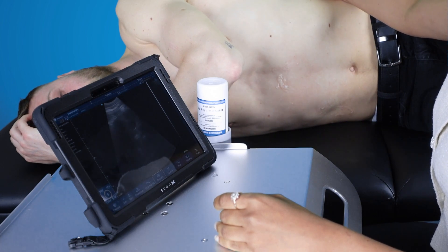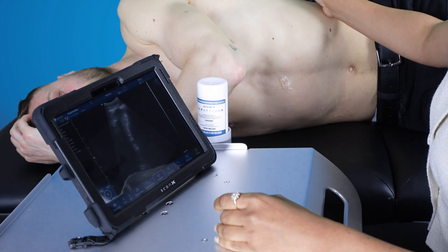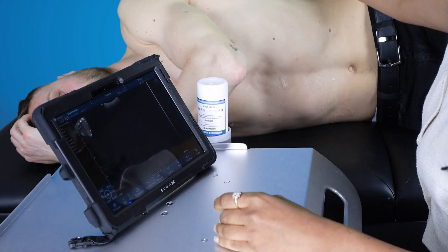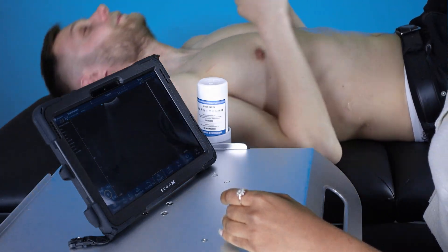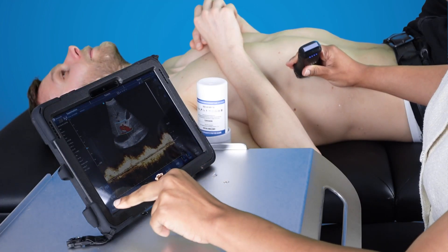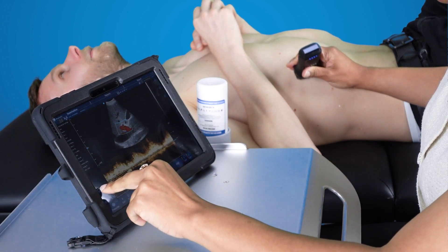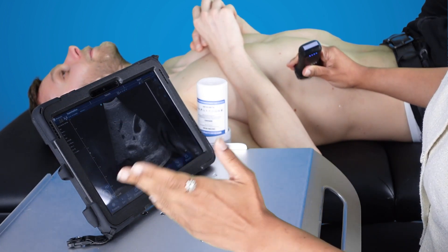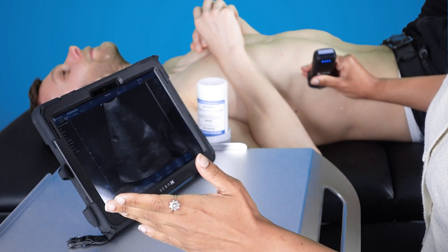We also trialled the curvilinear probe on abdomens and the resolution is great for settings such as scanning a patient in ITU, or if you'd like to triage a person before deciding whether the client is due to visit a more formal scan.